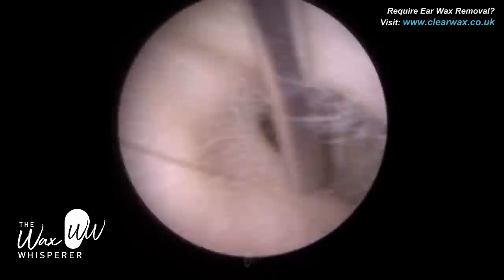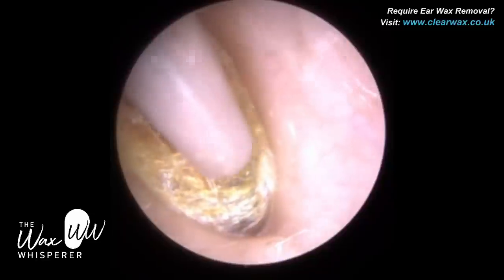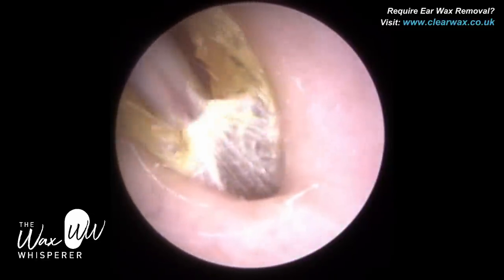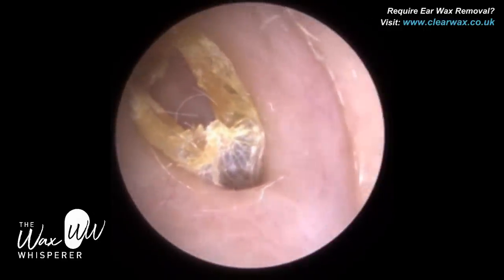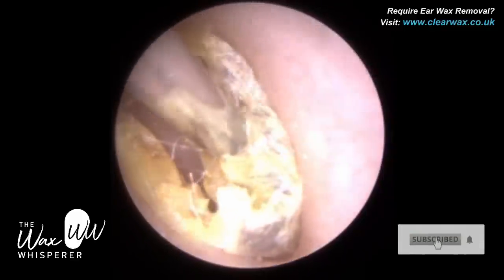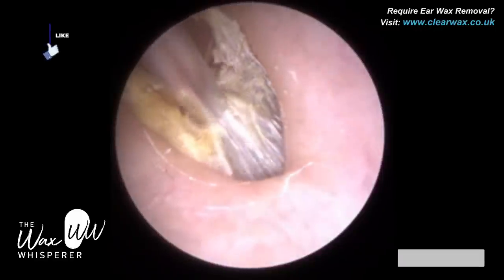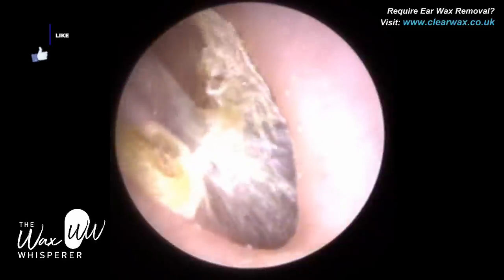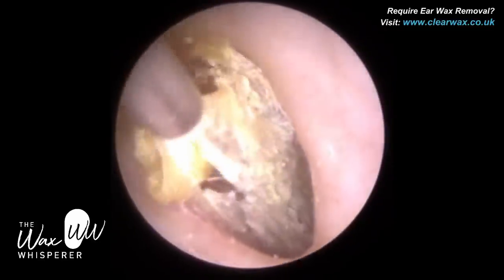This procedure is for all the people who enjoy dead skin peels. We have a dead skin peel from both ears from the same patient, including off the eardrums. It's a very delicate procedure in both ears. This client is a hearing aid client of mine and they attend every three months to have this dead skin keratin peeled off the medial ear canal, near to the eardrum, and the eardrum itself.